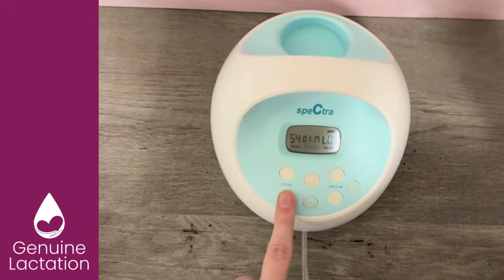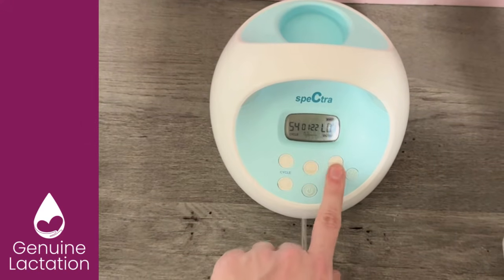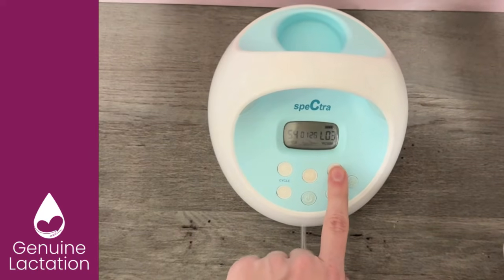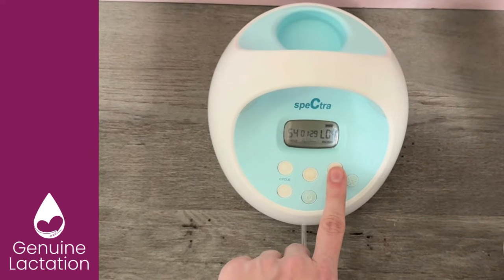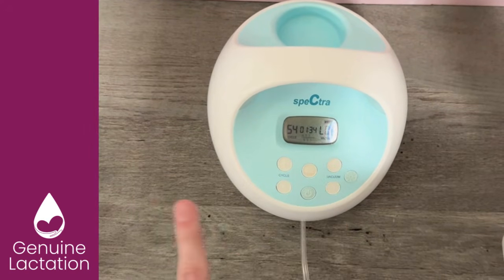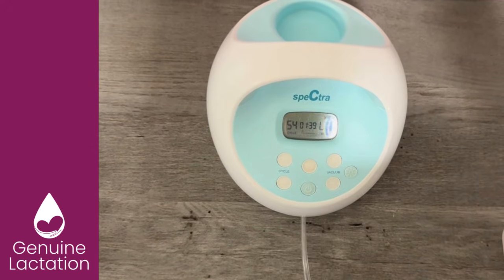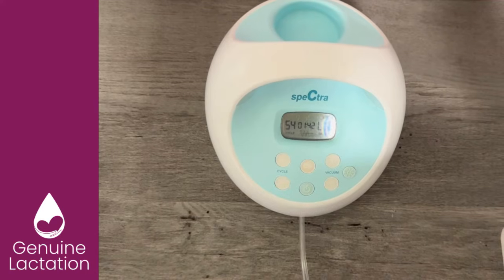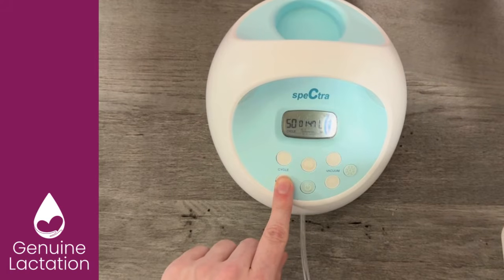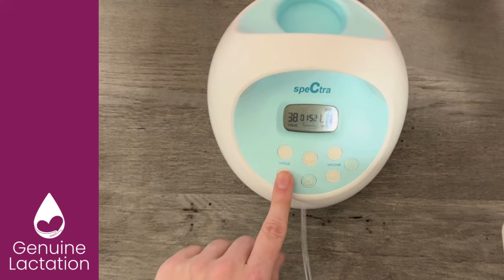In expression mode, you do have cycle choices. So I'm going to recommend starting in 54 for most people and moving up in the vacuum, again every 30 to 45 seconds, just until you feel a nice pull on the nipple for that release and to help pull the milk, but not so much that you feel pain. My recommendation is always going to be, if the vacuum feels good, but you wish the pull was just a little bit longer, that's when we go down in cycle speeds. So you've got from 54 when you start down to 50, 46, 42, and 38.